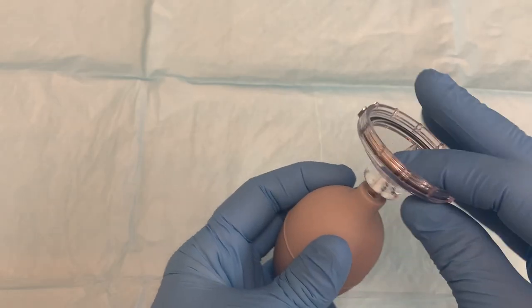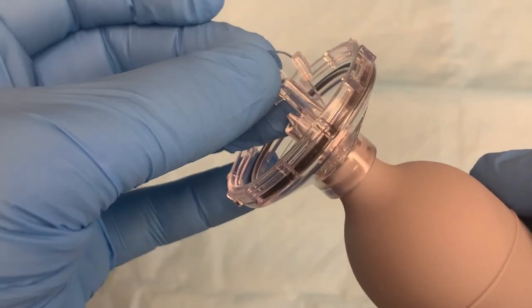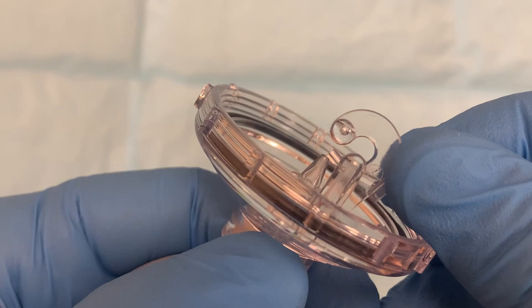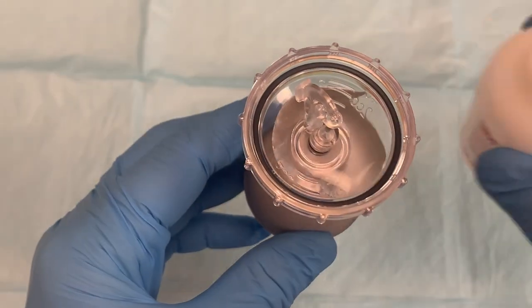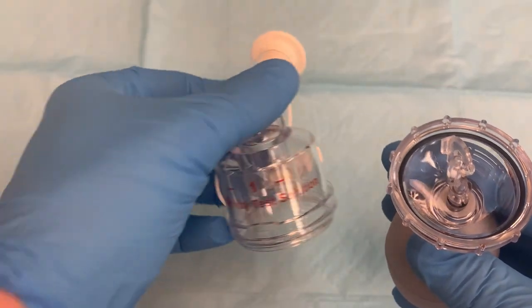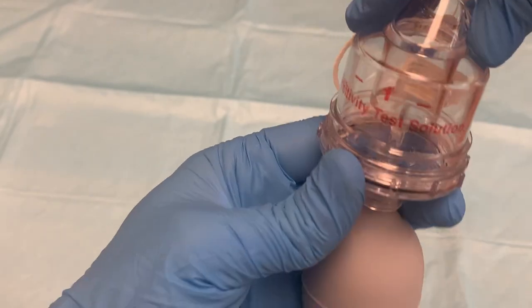Push the reservoir base onto the bulb opening until you cannot push them together any further. Then take the question mark insert and place it over the nebulizer tip. Gently push it down as far as it can go — it will stop when the tip touches a small spout on the insert. Take whichever solution you will be filling the nebulizer with and pour some into the reservoir. There are markings to indicate the volume; do not fill past the 4 milliliter marking. Then take the lid labeled for whichever solution the nebulizer was just filled with — in this case, we used the red sensitivity solution, so we will put on the lid labeled for that solution.